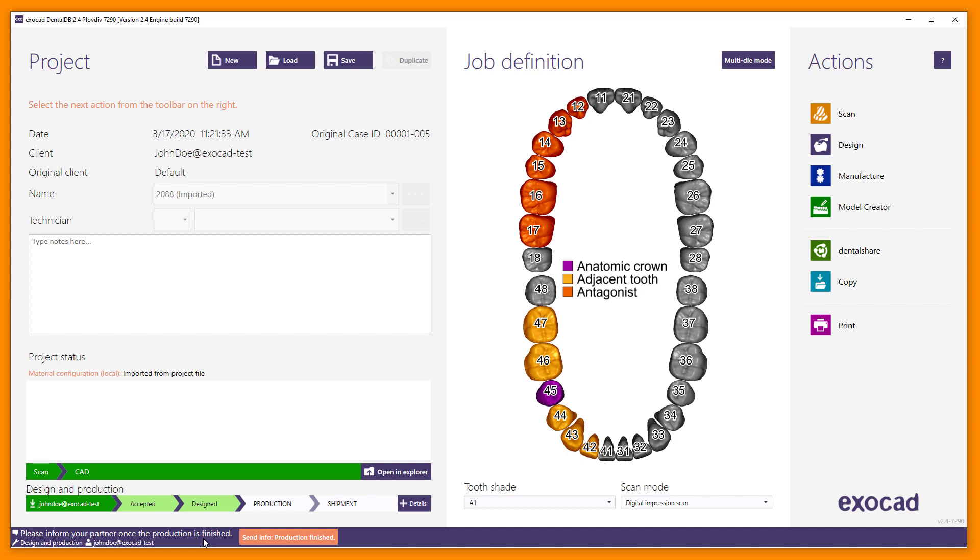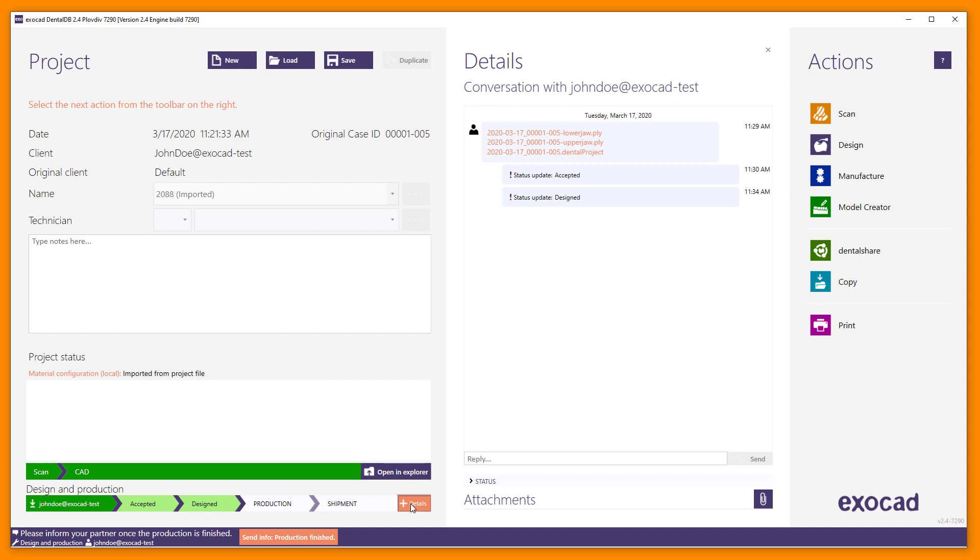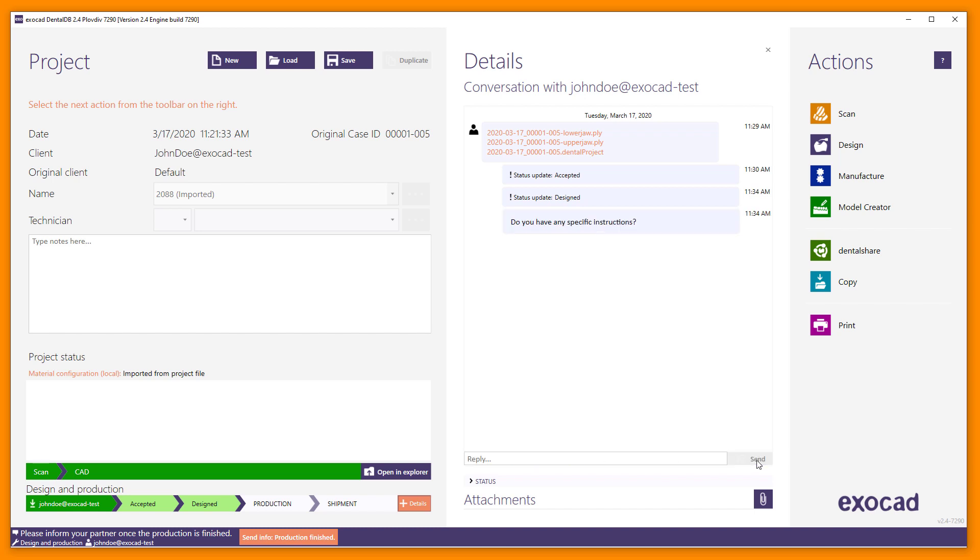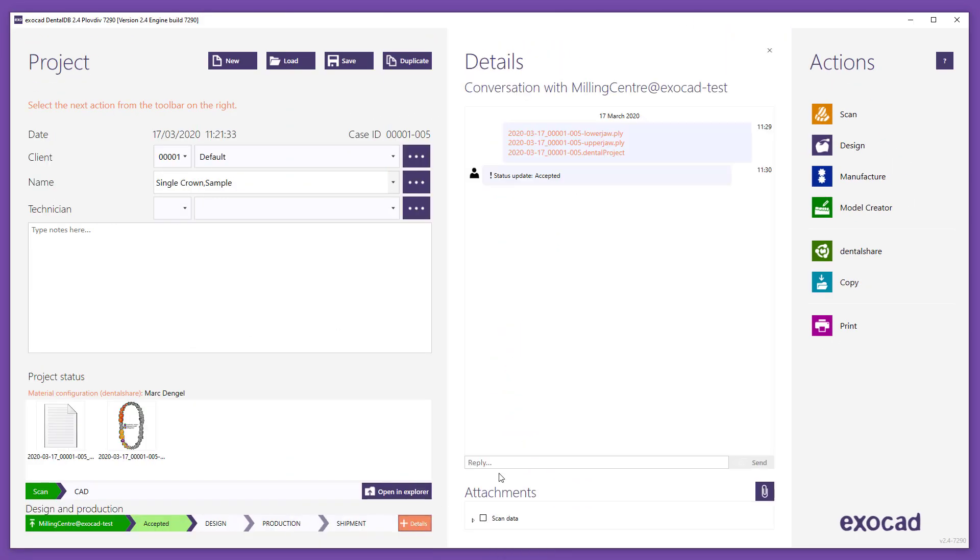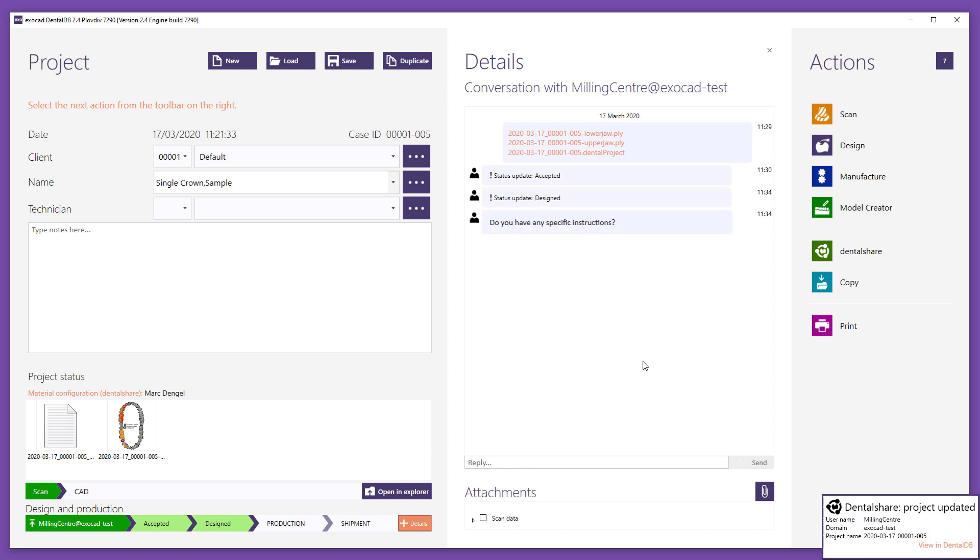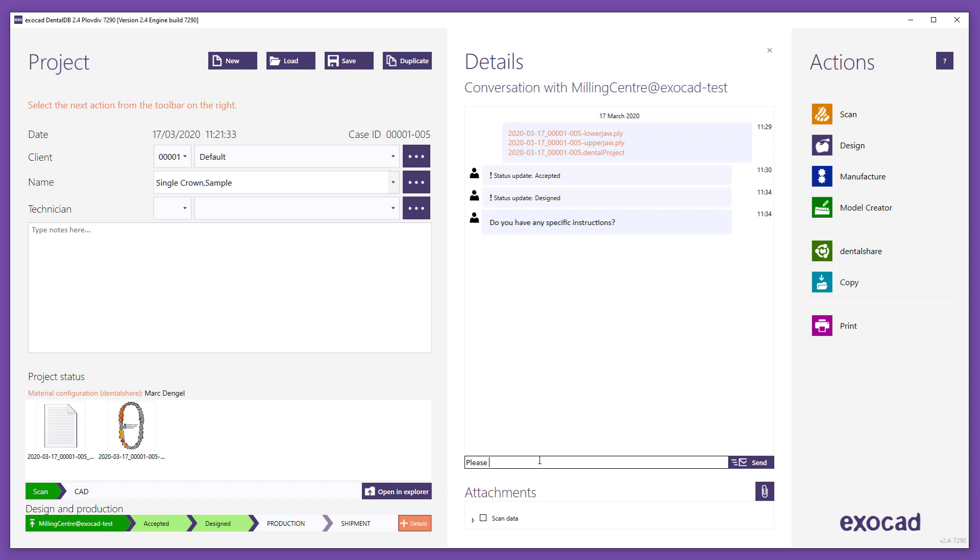You can open an additional info section in DentalDB by clicking on Details. The Details window shows the full communication history with your partner with all data transfers, status notifications, and messages for a project. It can be used for communication. You can type a message into the text field at the bottom of the window. Click Send to send the message. Please do not refer to this function as a chat function as sending and receiving messages is not instantaneous and depends on various factors such as DentalDB being open.